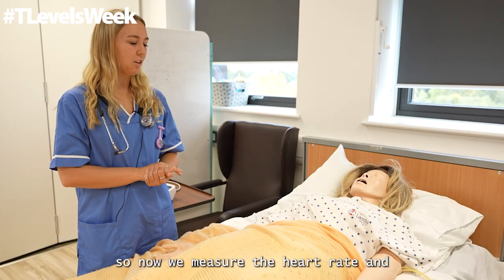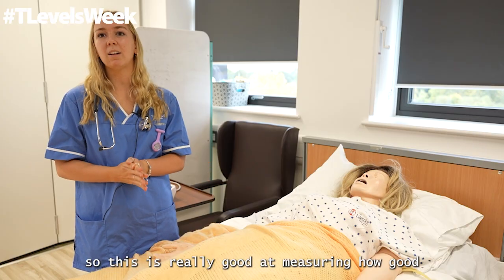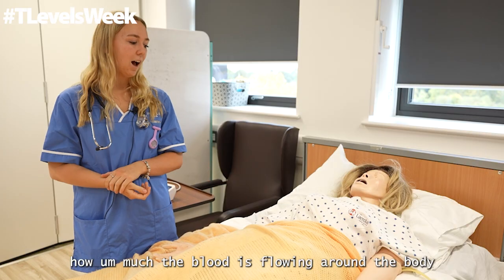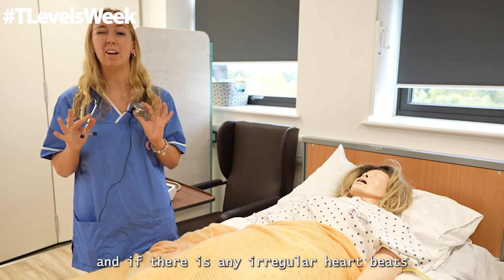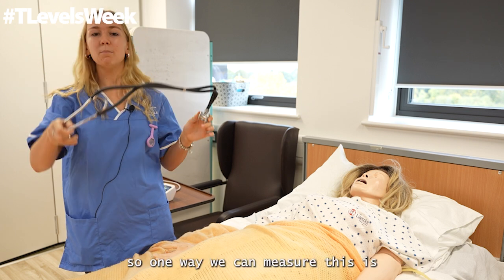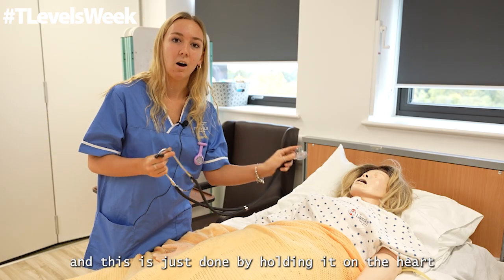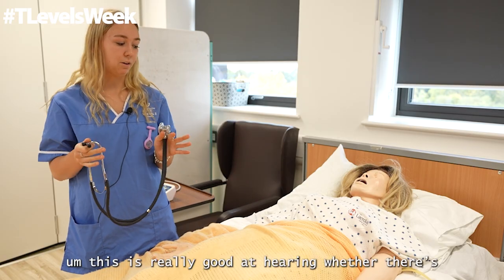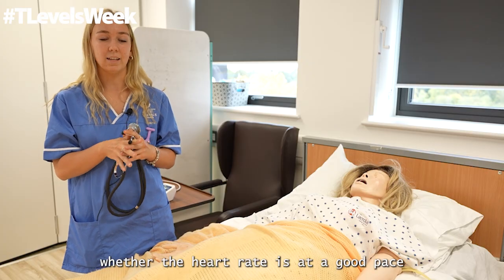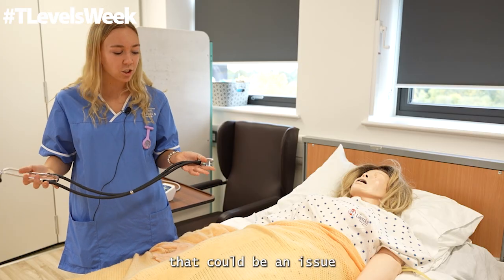So now we measure the heart rate and this is also known as the pulse. So this is really good at measuring how good the circulation is, how much the blood is flowing around the body and if there's any irregular heartbeats. So one way we can measure this is with a stethoscope and this is just done by holding on the heart and listening through these ear holes. This is really good at hearing whether the heart rate is at a good pace or if there's any irregular patterns or anything that could be an issue.